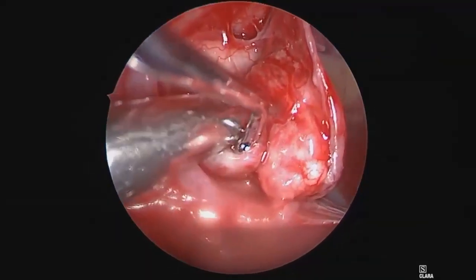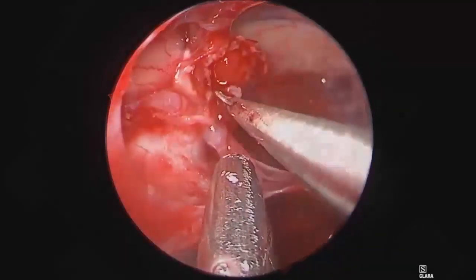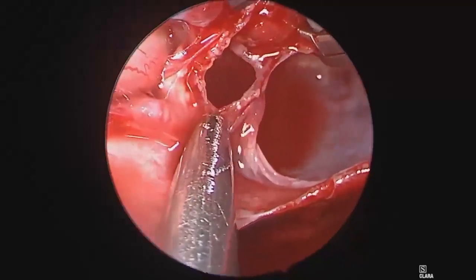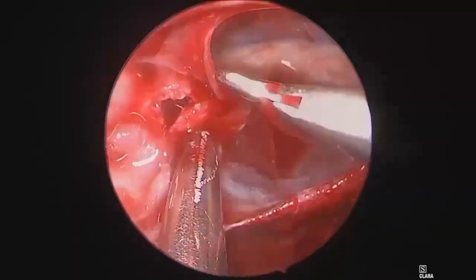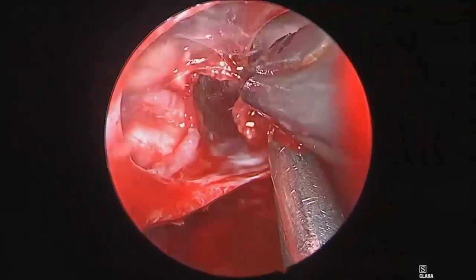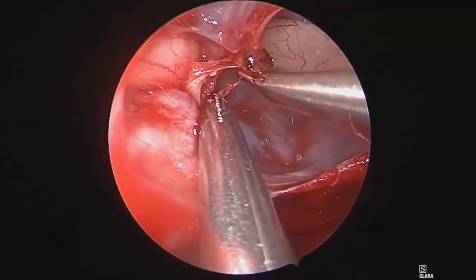Planes here are developed to deliver the last remnant of disease that may have been stuck in the optic canal. And then finally, once the last residual component of the disease has been isolated, the thin attachments of arachnoid that may contain some vessels are isolated and then coagulated. Once this is done, it is safe to use microdissection and remove the last remnant of disease.